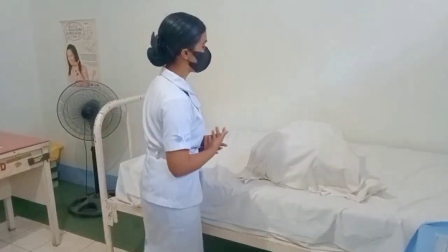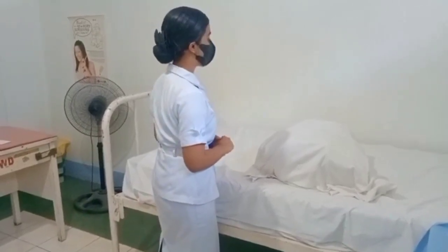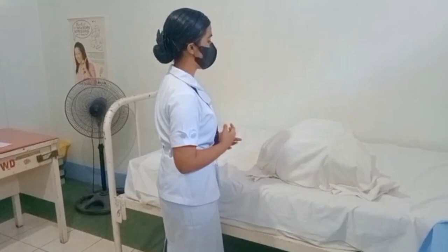So, good day ma'am. My name is Rhea Banasagdinos from Mabini Colleges. And I am your student nurse for today. May I know your name, your birthday, ma'am? Okay. So, for today ma'am, I am going to assess a catheterization.